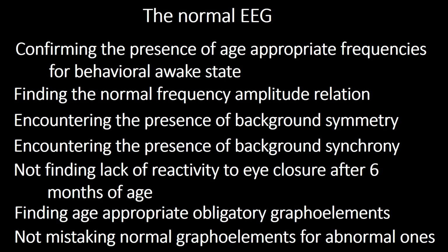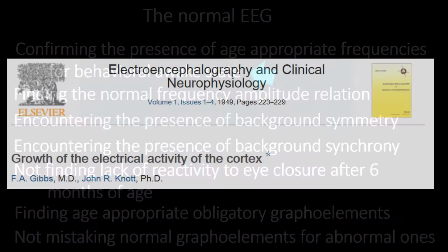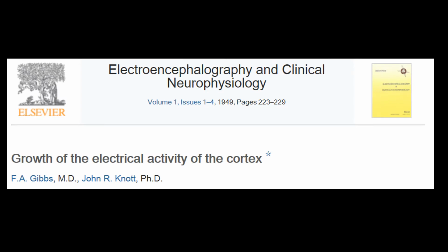I will, in this conversational section, address each of these previously stated principles individually. So let's start talking about appropriate frequencies for the awake state. And I will do so by introducing to you this article. This article was published in 1949. This article is certainly not an easy read. In it, you find an even more complicated figure, which you can see in this frame.